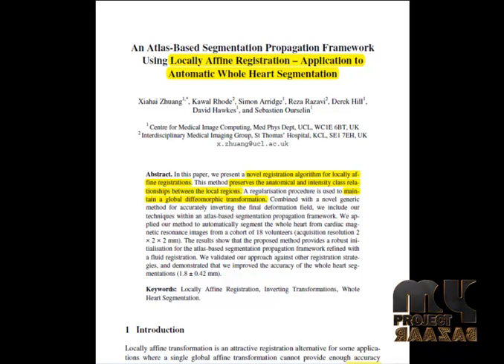Initially, we remove the noise from the image. For removing the noise, we use a filter. The watershed algorithm needs an inner marker line and an outer marker line. For predicting these lines, we use the morphological function. Morphological operation is a collection of non-linear operations related to the shape or morphology of features in an image.